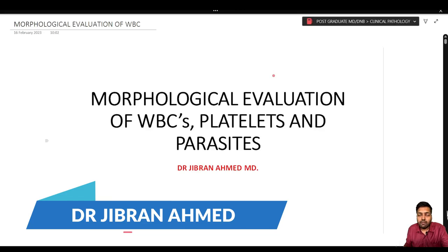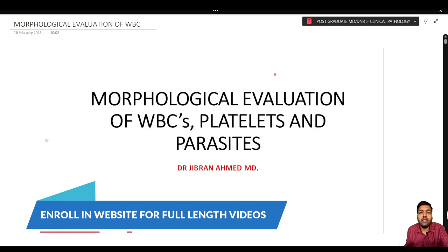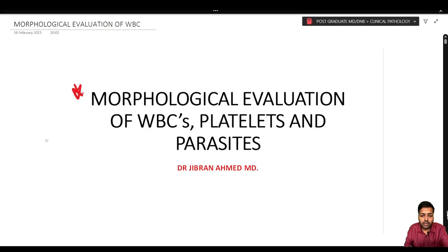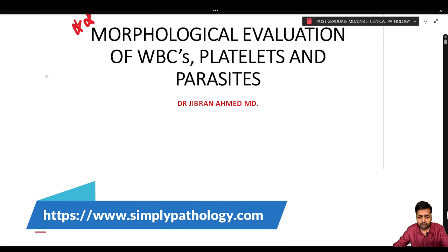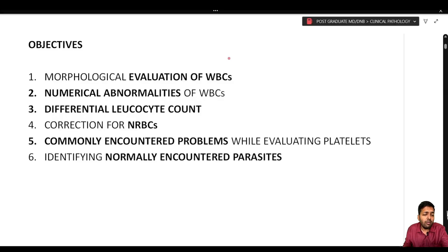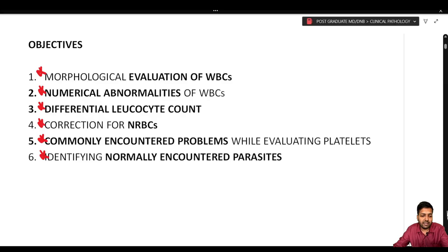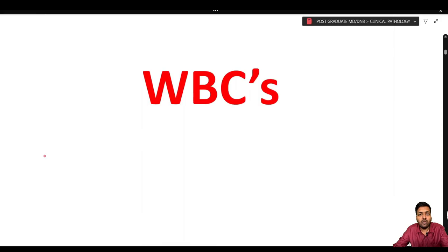Dr. Gibrahan Amad presents to Simply Pathology. In the previous lecture, we started the basics of the peripheral blood smear. Today we continue the discussion, concentrating on the morphological evaluation of the white blood cells, platelets, and parasites.